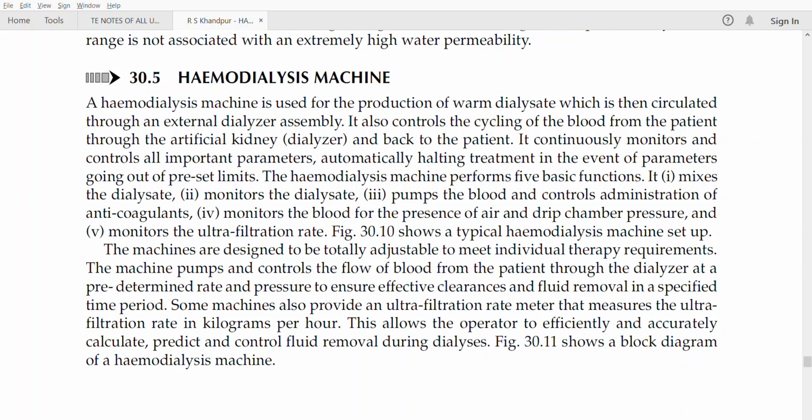In this video, I will be guiding you through various different submodules involved in a hemodialysis machine. If it is a question asked in the exam, you should be in a position to write all these details that I'm briefly elaborating, in detail. While I will briefly elaborate what the different things in a hemodialysis machine are.